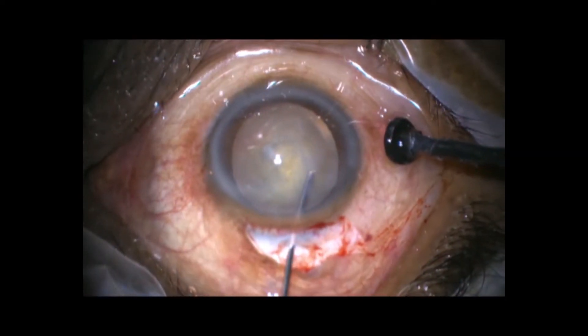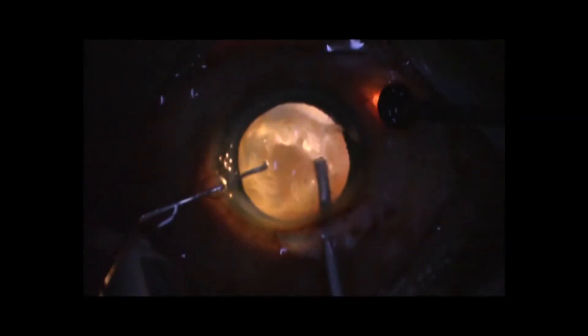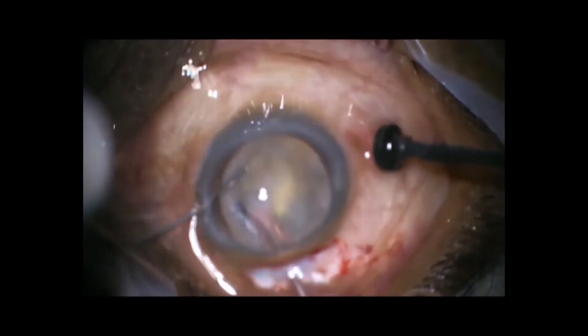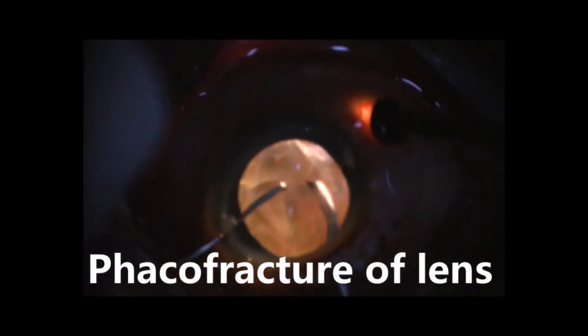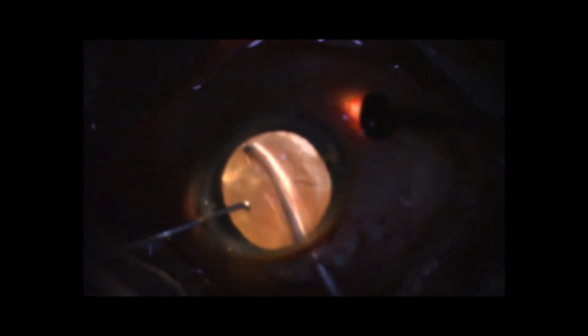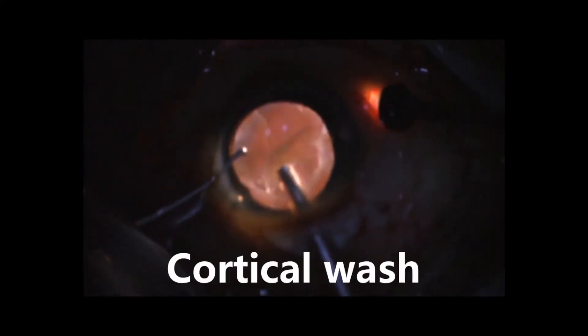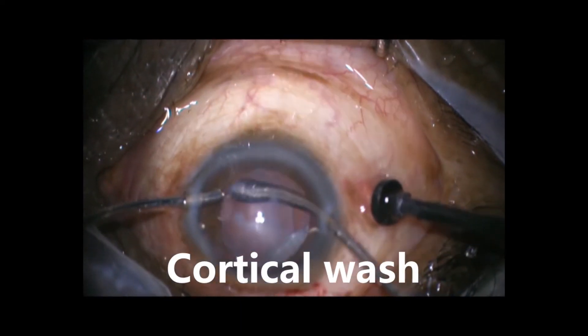Hydrodissection was done. Endoilluminator-assisted nuclear fragmentation was done and emulsification completed. Cortical aspiration was also completed with endoilluminator assistance.